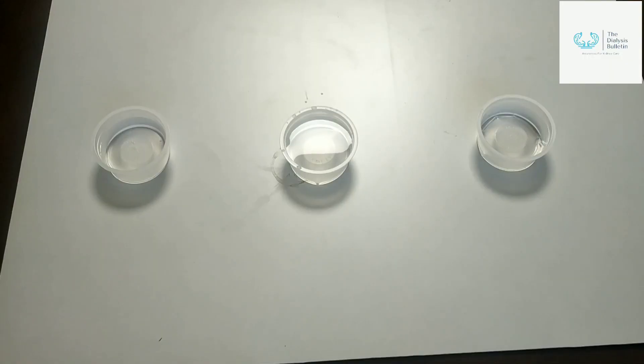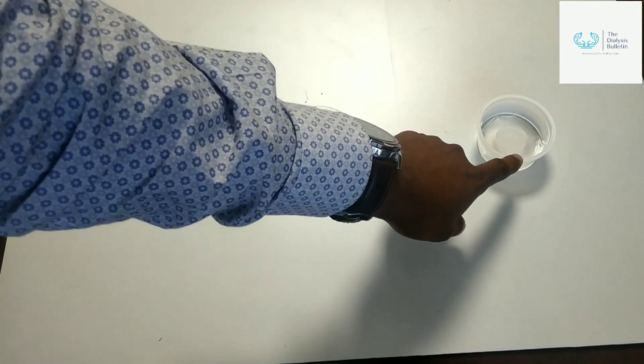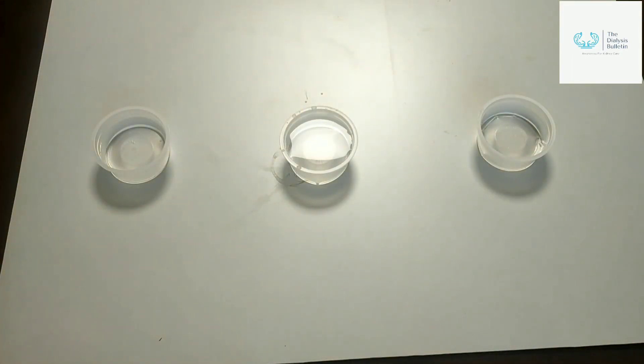Here we will take some water like raw water, softener water, and product water, and we will check the TDS and show the readings. I will measure three types of different water which we generally use in dialysis: one is raw water, second is post-softener water, and third is product water.